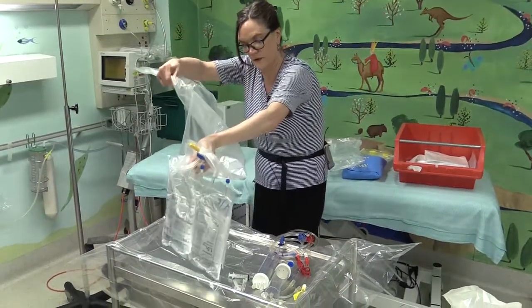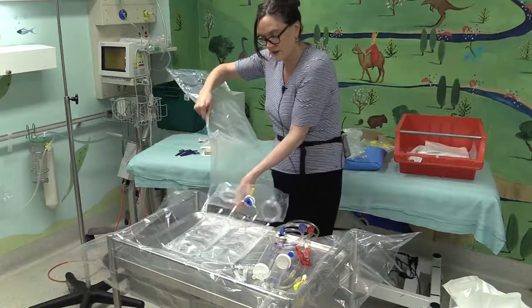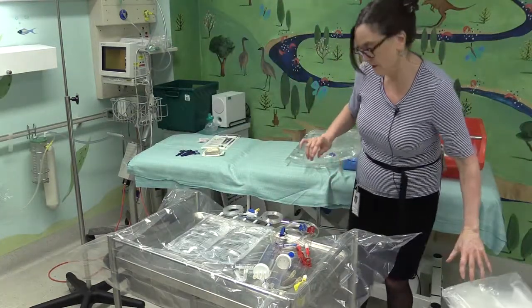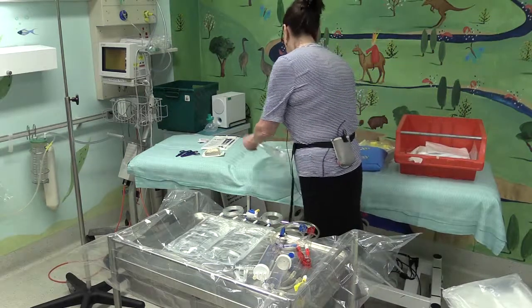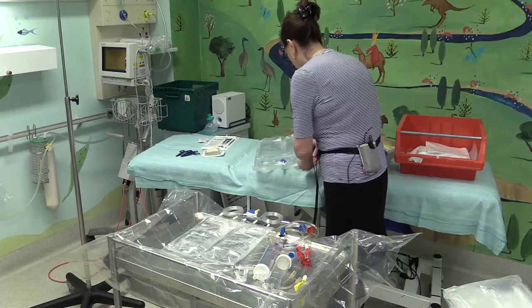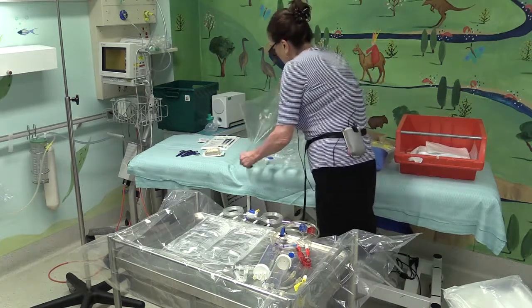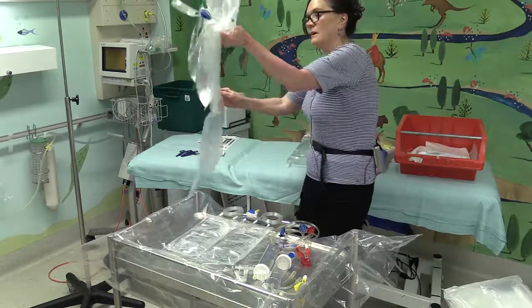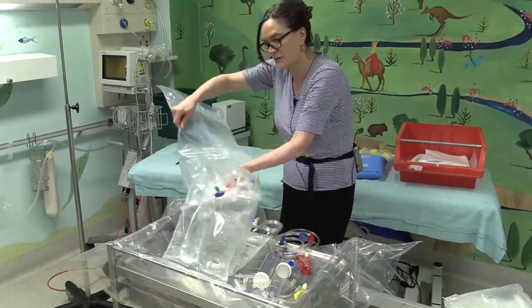I'll drop them onto the sterile field. One on top of the other.